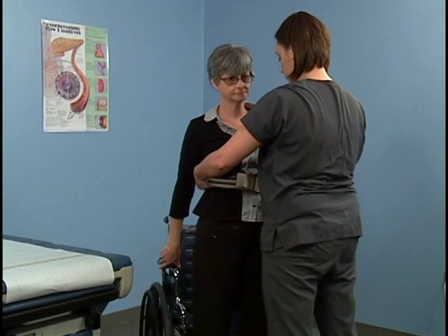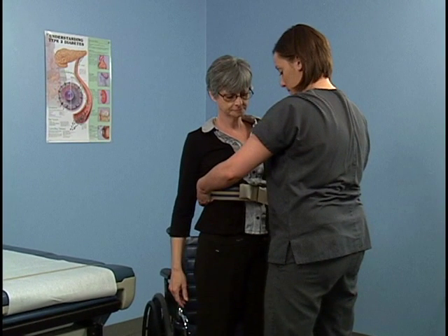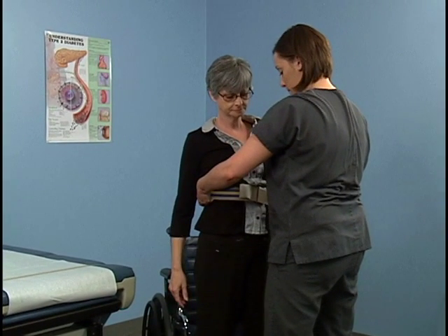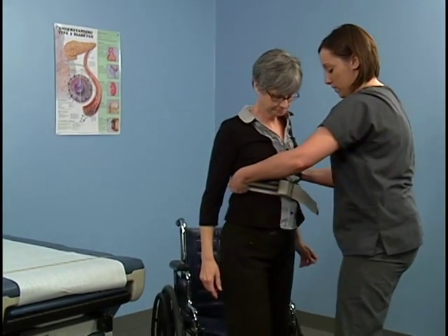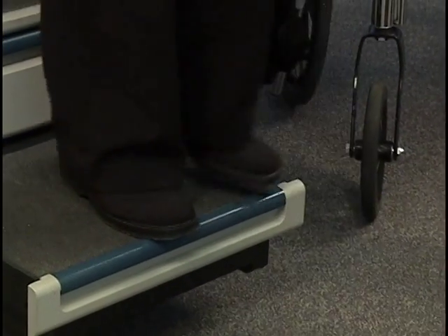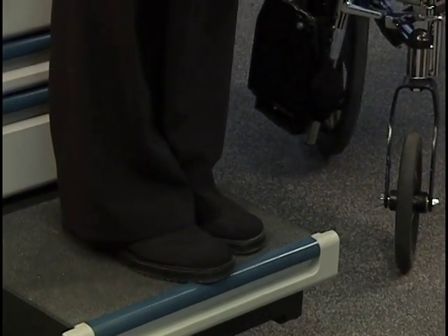Straighten your knees and assist the patient to a standing position by pulling upward on the transfer belt. Make sure to keep your back straight and lift with your knees, arms, and legs, and not your back. Pivot and position the patient's buttocks and back of the legs towards the examining table. Instruct the patient to step backwards onto the footrest, 1 foot at a time.